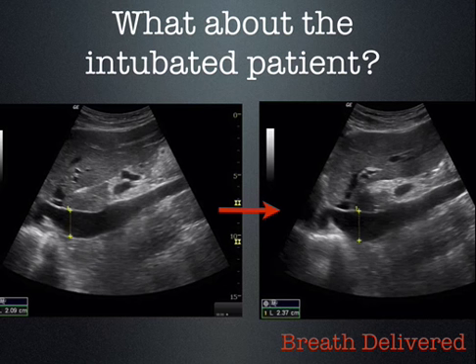Deliver that breath, right? So here's end exhalation, 2.09 centimeters. We gave a breath and it dilated to 2.37 centimeters. If it's much greater than 15% dilation, then you can feel pretty comfortable that that patient is going to be fluid responsive, okay? With all these other, by the way, we were talking about really more fluid tolerance. Let me take a step back. It's not been well studied, actually.